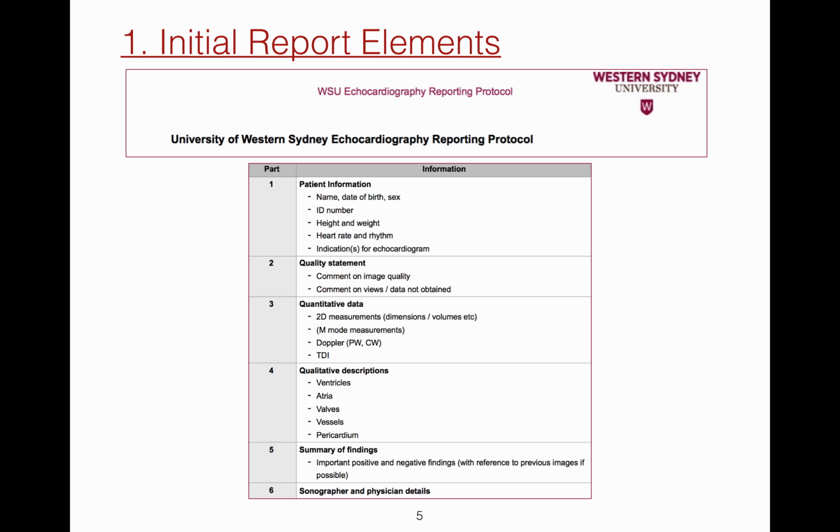An important aspect of a sonographer's role is being able to communicate the findings from an exam in both verbal and written forms. That is, the sonographer's role extends beyond simply acquiring and measuring images. It includes providing a description of the images and measurements in connection with the indication for the exam. Often, this occurs in the form of a written report, essential elements of which I'll discuss in this lecture.